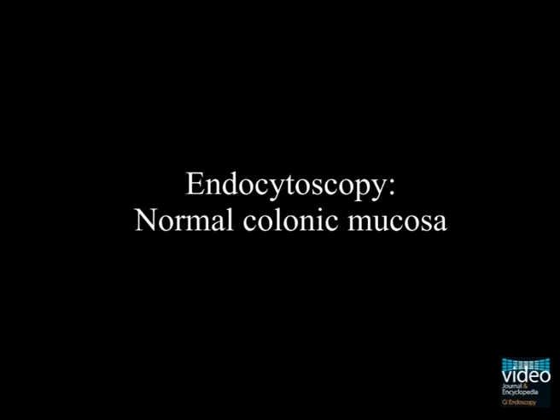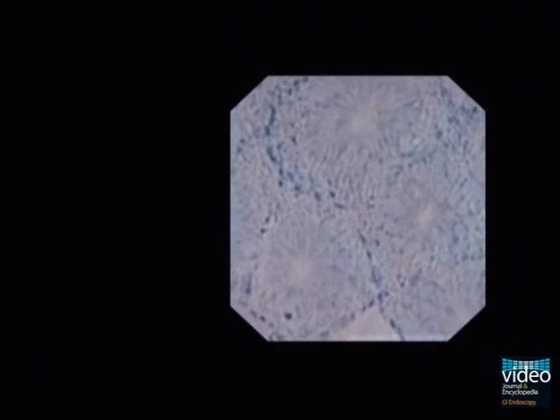Endocytoscopy performed on normal colonic mucosa reveals uniform appearing glands which are regularly arranged. Each gland is lined by epithelium which is arranged in a radial fashion.